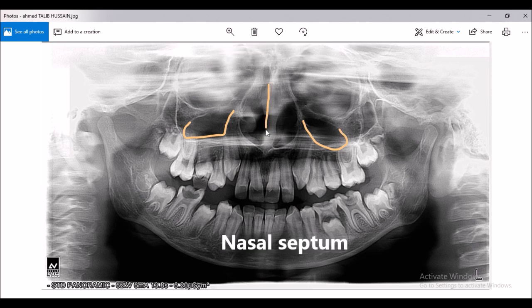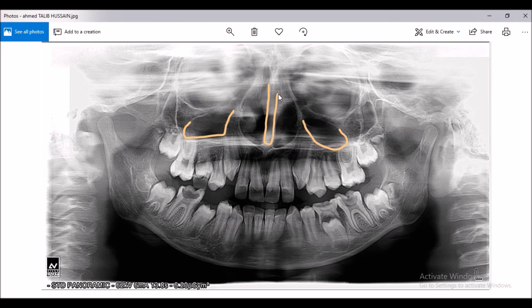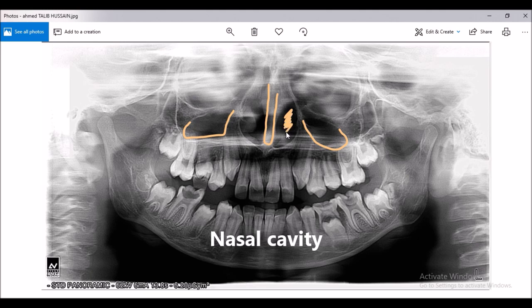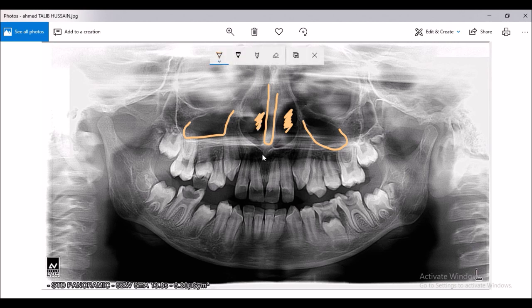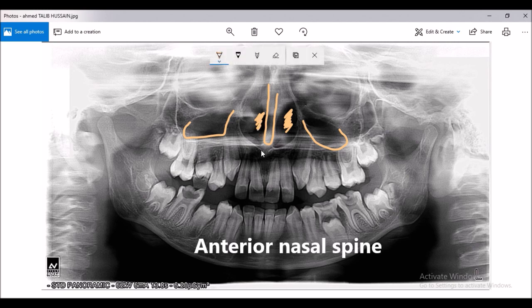This space is the nasal septum — you can see this is the nasal septum. This space is the nasal cavity, and this pointed area is the anterior nasal spine.